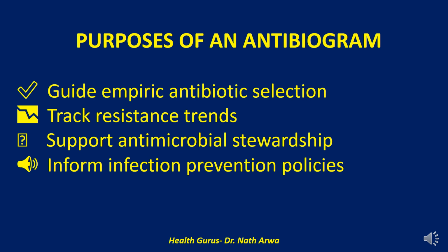Second, antibiograms help us track how resistance is changing over time. A certain bacteria becoming more resistant, a previously reliable antibiotic starting to fail. Antibiograms give us the long-term view, revealing the direction of resistance in your hospital, region, or country.